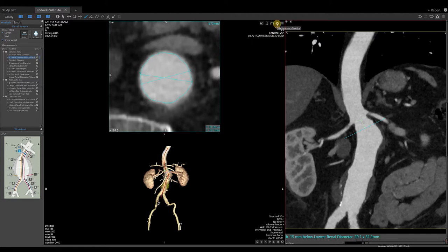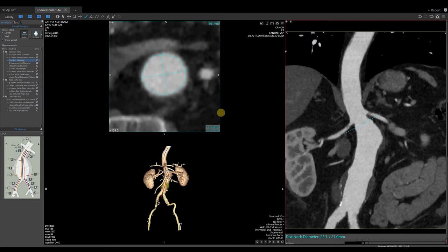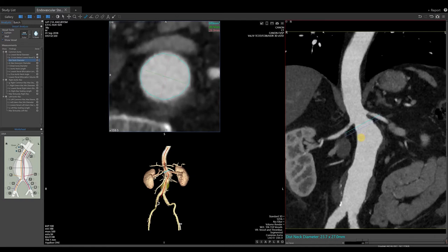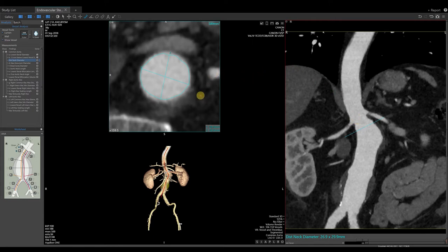Take a snapshot to record your progress. Select our next measurement from the worksheet, distal neck diameter. Once again, the software will automatically place the line where it believes is the distal neck diameter. If you disagree, you can roll the mouse wheel to change the location. Notice the dark blue line is the line that moves when you roll the mouse wheel. If you have changed locations, left-click and drag the light blue line to superimpose over the dark blue line. Edit the diameters if necessary, as in previous steps. When you agree with the measurements, check the box to lock the measurement in place and take your snapshot.